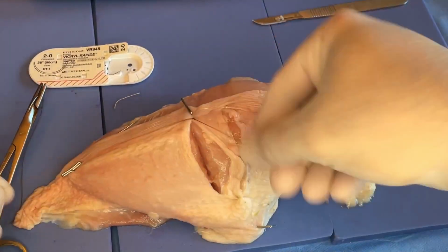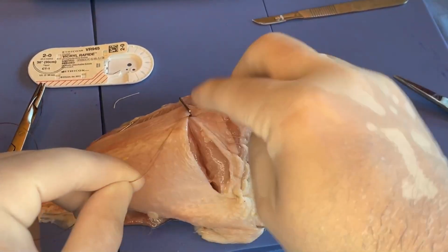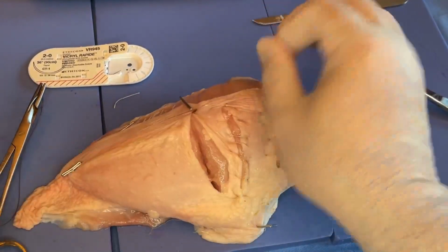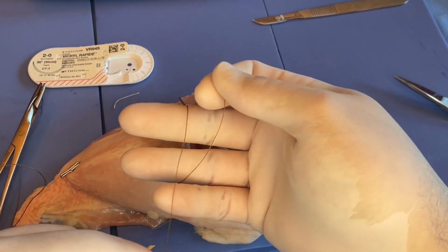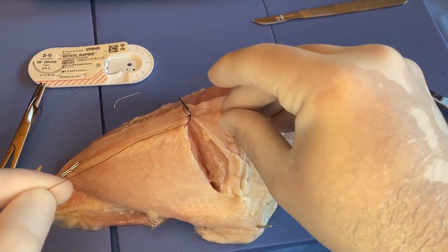And so again, over those middle two, index, middle two, index. Oh, that one slipped out. Like that. So laying down again. Some people do over all three fingers here. I tend to just over the two, make that loop, snag it, pull it through. So this free end is always under control.